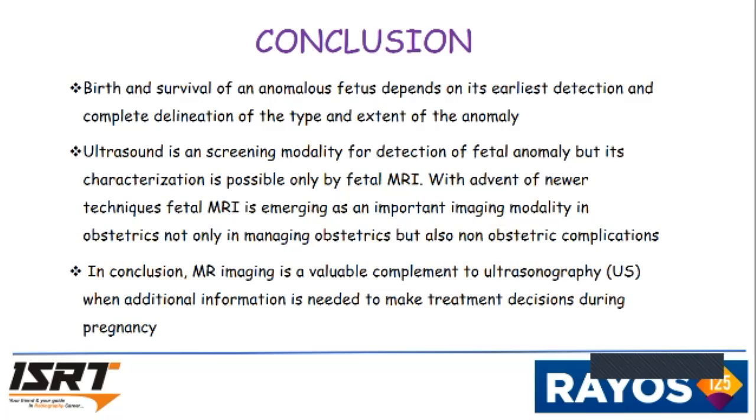In conclusion, MRI imaging is a valuable complement to ultrasound when additional information is needed to make treatment decisions during pregnancy.